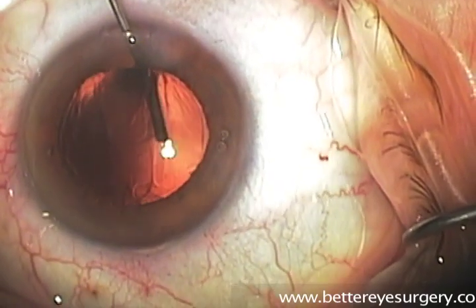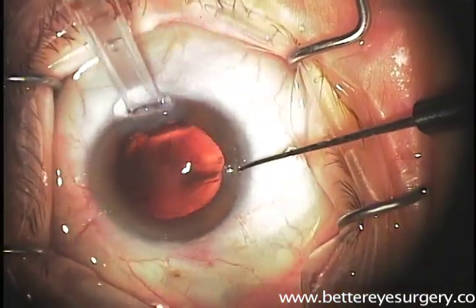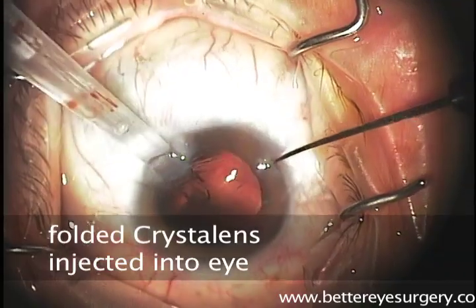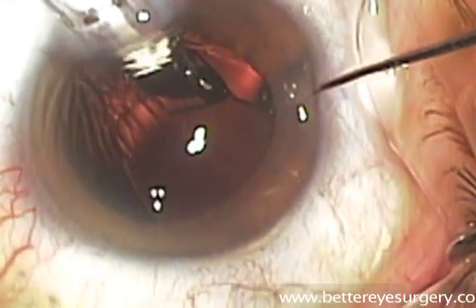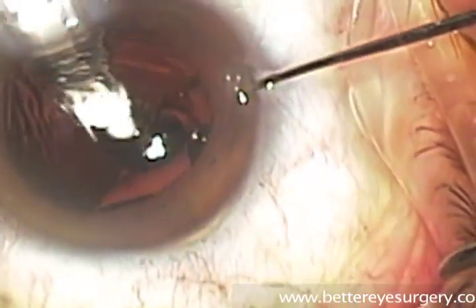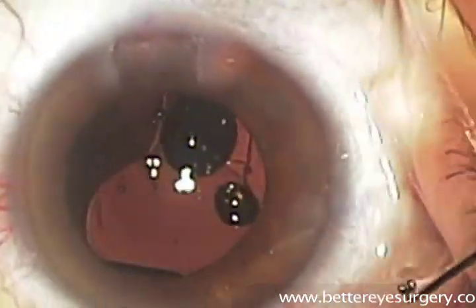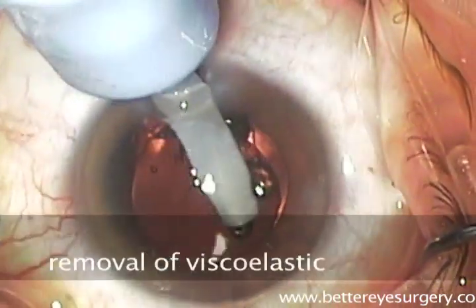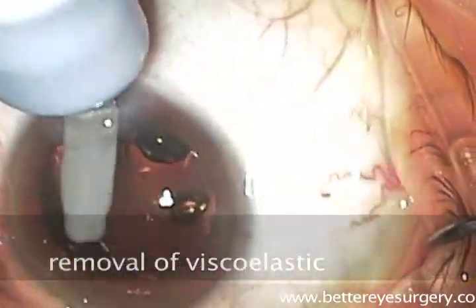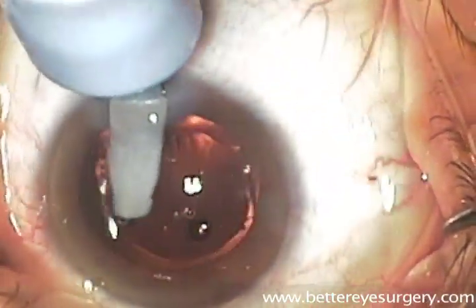We then place the viscoelastic — the dense clear material that holds the lens capsule into its shape — inside the capsule. Next we take the lens implant, here a crystal lens, which has been folded, and we inject it into the eye using an instrument that allows it to be directed right into the center of the lens capsule where it will remain for the rest of the patient's life. The lens is then manipulated using the irrigation aspiration instrument, and the viscoelastic material is removed.